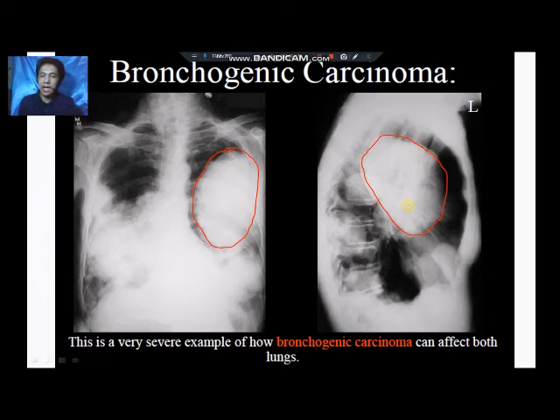If it is not clear in both lateral and PA, then that's the time the patient should be recommended for a CT scan examination. For metastatic cancer, sometimes there are no clear borders, with crab-like projections, so it is not clear in plain radiography, and the patient should undergo a CT scan exam.